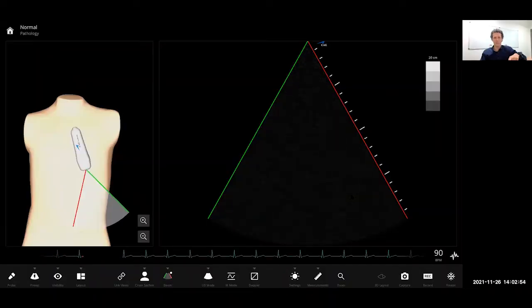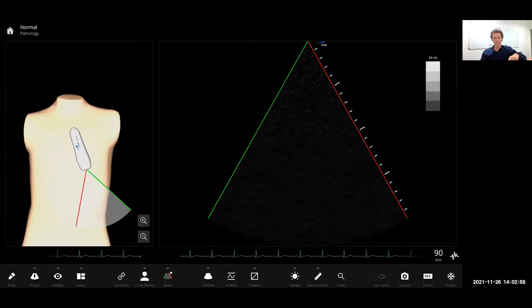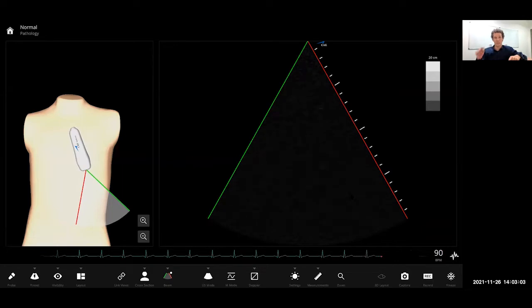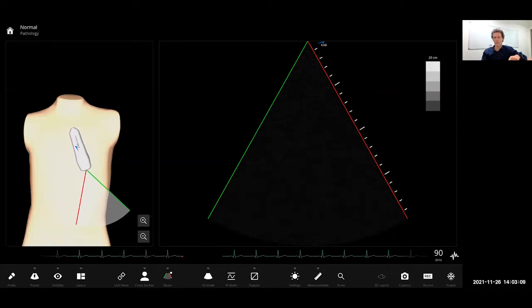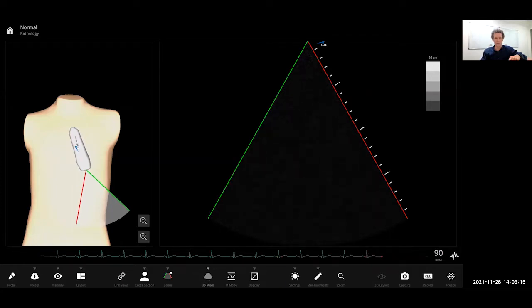Hi everyone, welcome to DDU teaching for this week. I'm going to do a little bit on tips and tricks for transthoracic echo in the critically ill. I'm going to use Bob, the echo simulator we've got here. He's quite useful for showing a couple of useful little tips and tricks that I think are important to look at for the critically ill.